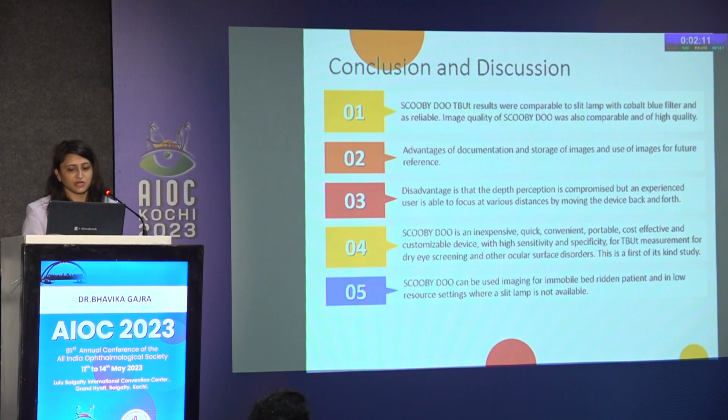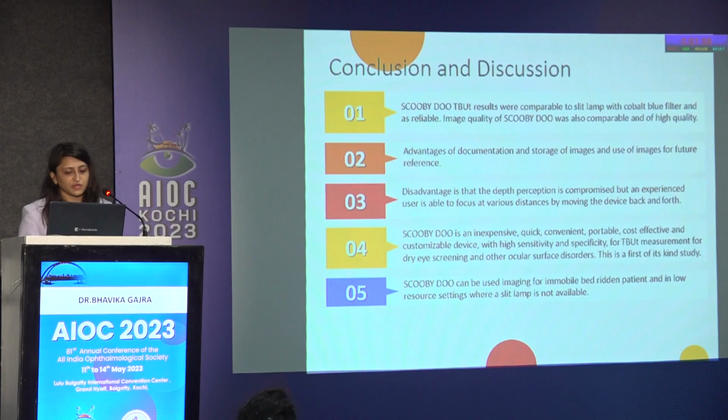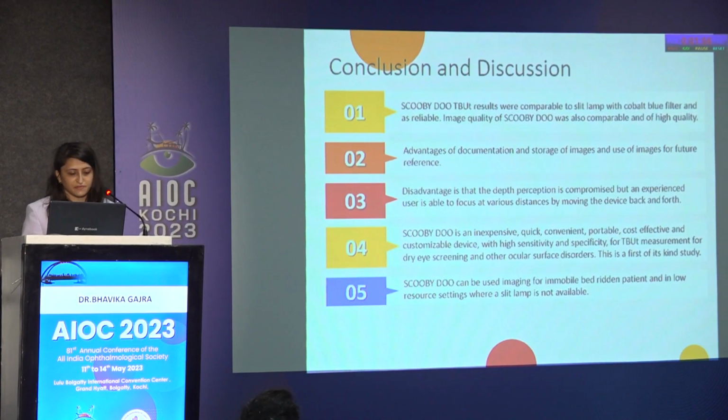The image quality was also comparable and of high quality. There are advantages of documentation and storage of images with SCOOBY, and also these images can be used as future reference. The disadvantage is that the depth perception is compromised. But an experienced user can focus at various distances by moving the device back and forth.